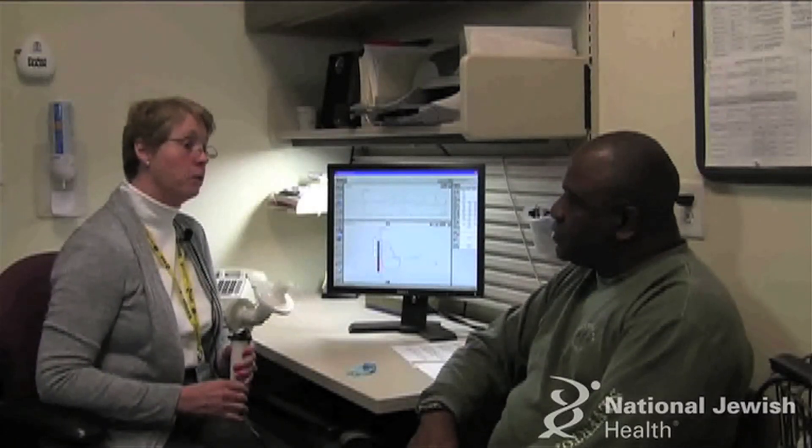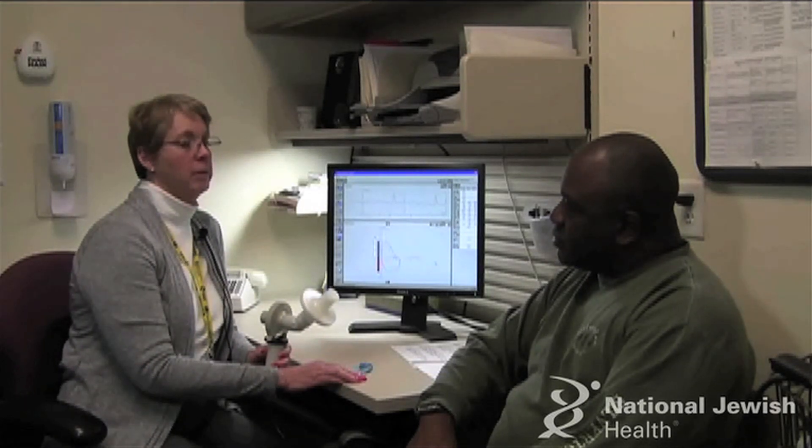This is a breathing test called Spirometry. It is a measurement of how much air you can take into your lungs and how fast you can blow it back out.